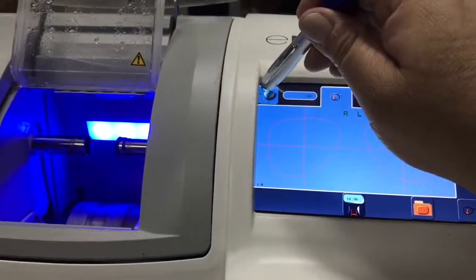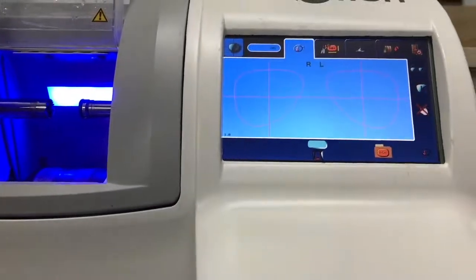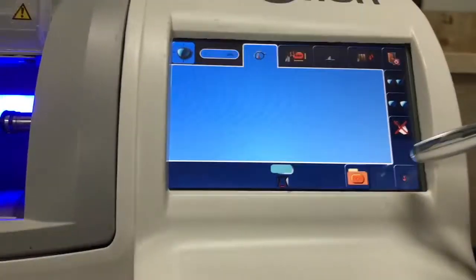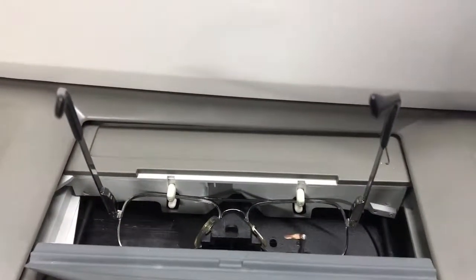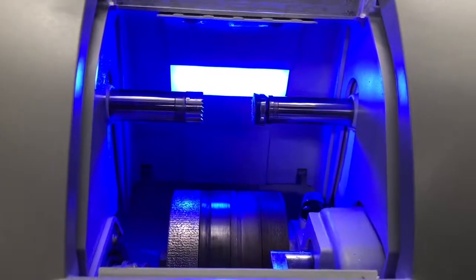I want to start by tracing. We input a job number — make it 205. I will start. It's ready, so we just press here and place the frame. When it traces, I can show you inside — the wheels are in great condition.